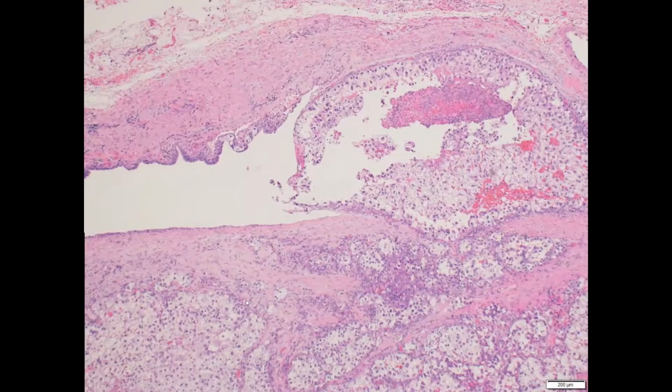And in those situations, you have to look carefully and see if it's involved in the calyceal system, because you can assign T3A grade stage even in that situation. So that's the end of the kidney session.